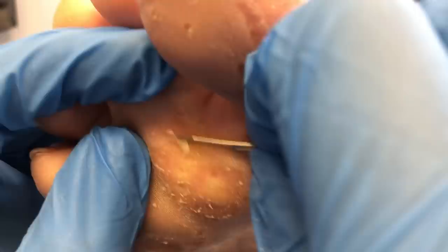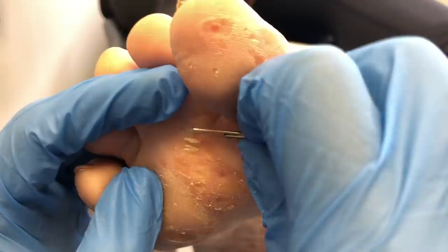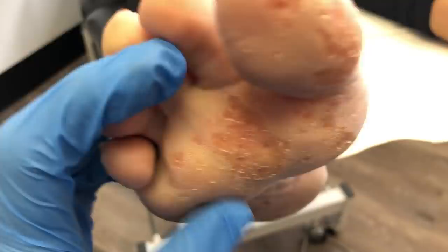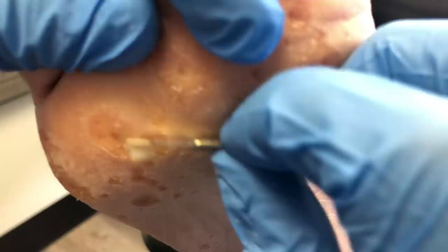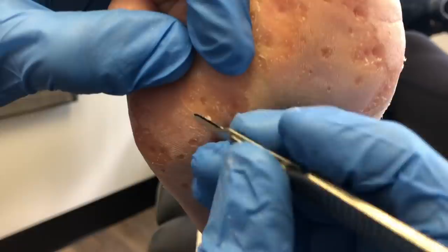I'm using the belly of the blade, which allows me to take off more tissue. On some of these corns the belly of the blade almost matches the diameter of the corn, so it lets me take out the inner core. On a couple of them I'll actually try to enucleate the corn — the enucleation technique is when I switch to a pencil grip approach, using almost the tip of the blade at a 90-degree angle to really get in and get the corn out.